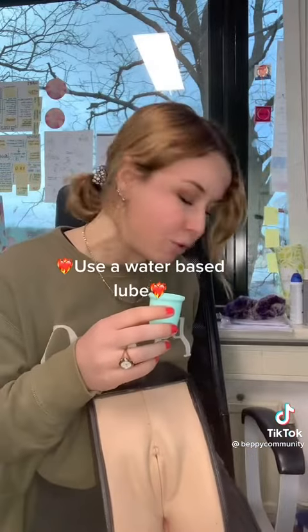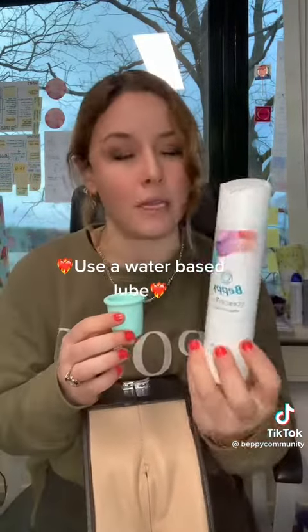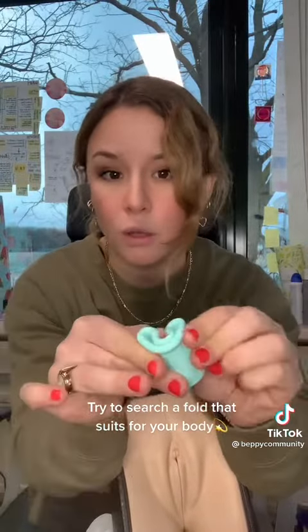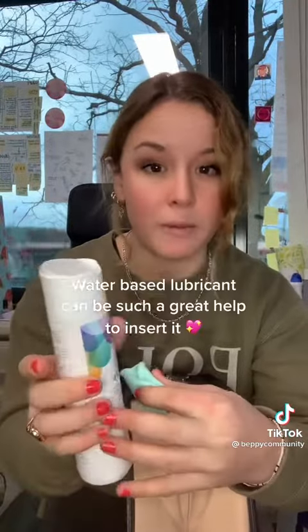To insert a menstrual cup, I highly recommend using some water-based lubricant — I'm going to use this Beppy lubricant. What you want to find is which fold works best for you specifically. You can try the punchdown fold, the U fold, or the seven fold — you have to search what works best for your body. My personal favorite is the punchdown fold.